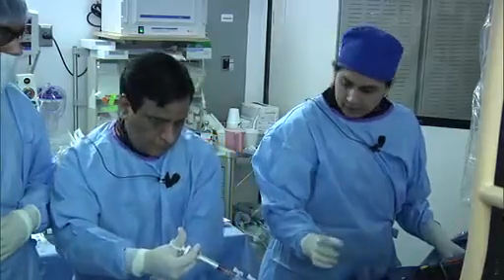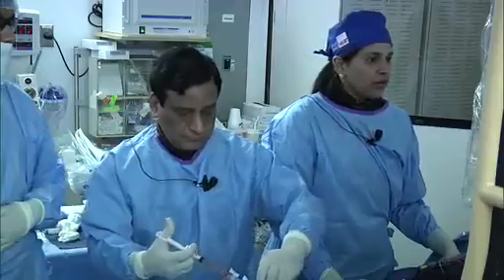So once we do, always before you wire, we take a picture.